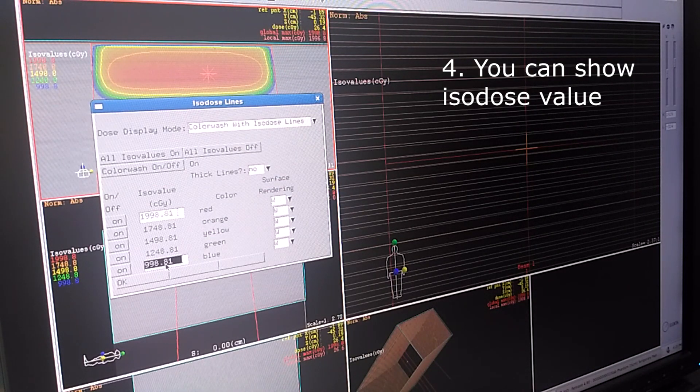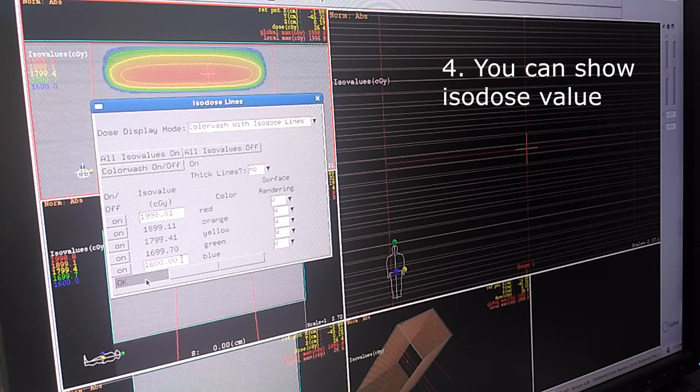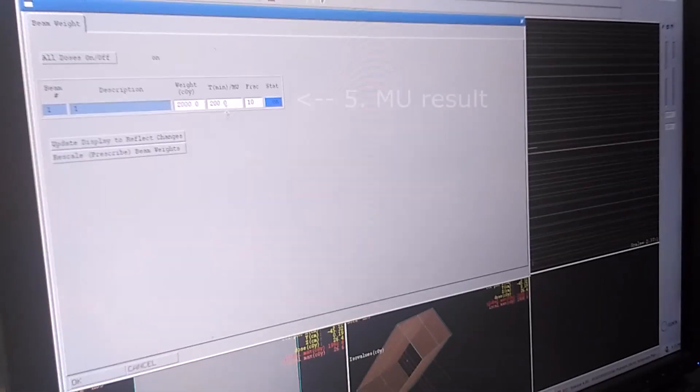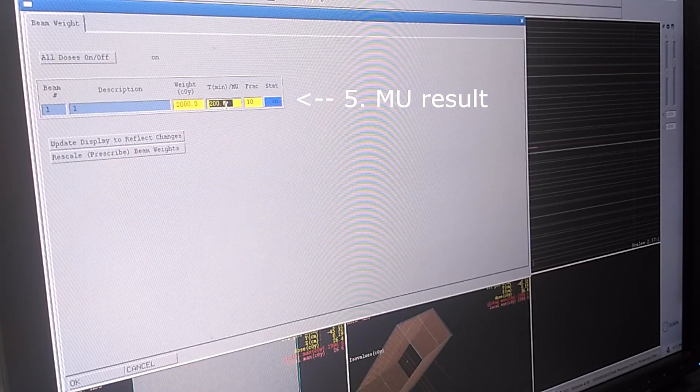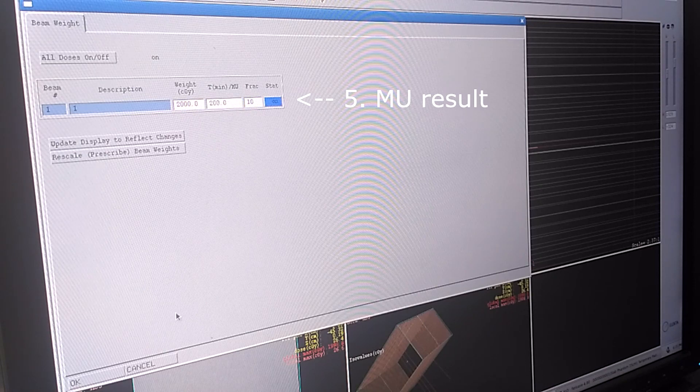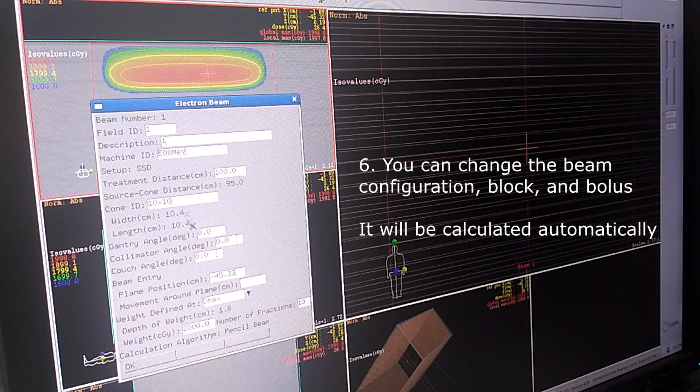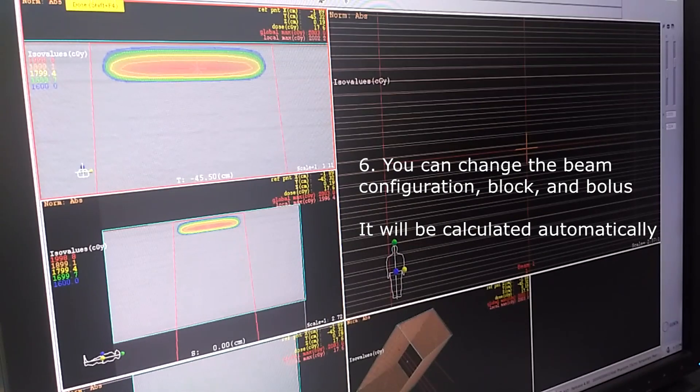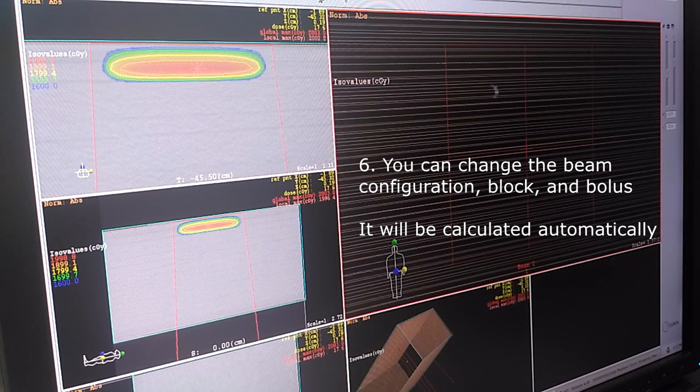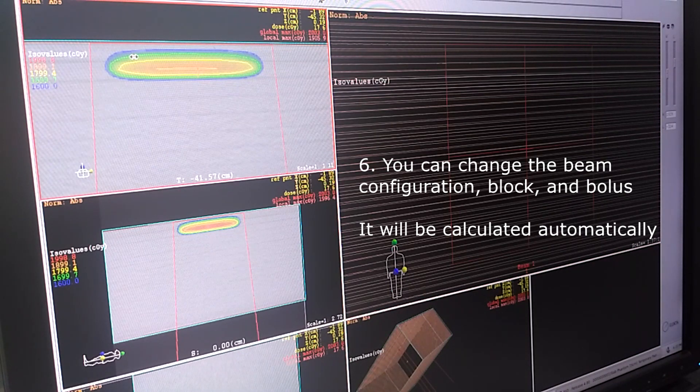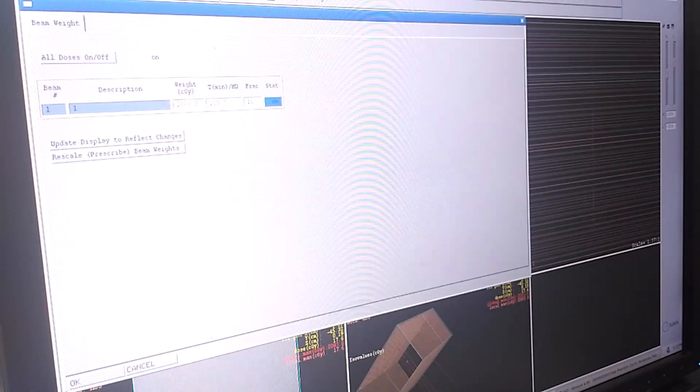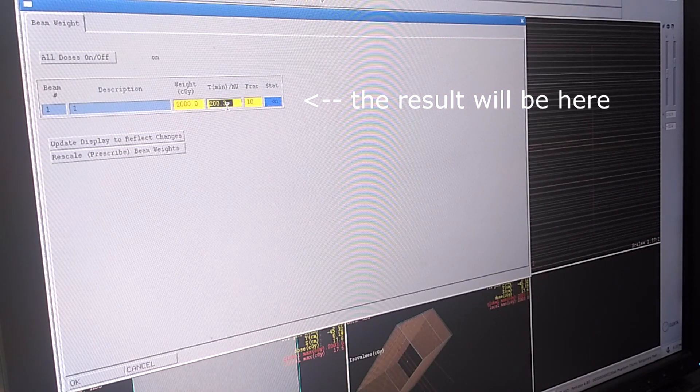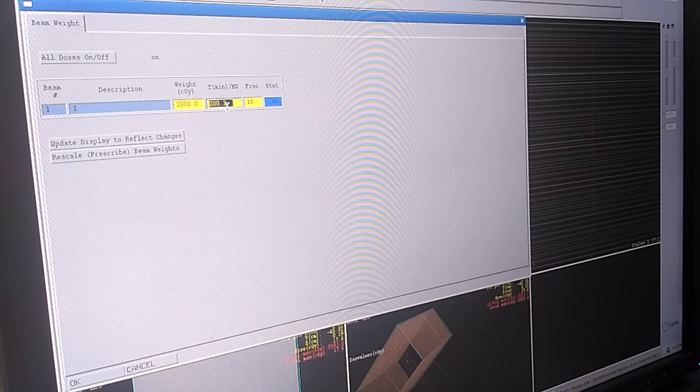We can see the calculated iso dose here and change the value into 80 percent like this. And the MU calculated already here and it's rather that simple. If you need to change the parameter you can choose edit beam. For example maybe you need 6 MeV and then you need to change the block, you can draw it again like the first part of the video. Or you can use bolus of 10 millimeter, 5 millimeter and so on. You can just see the MU here and you give it to RTT.